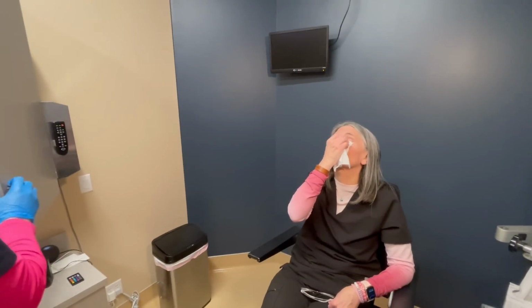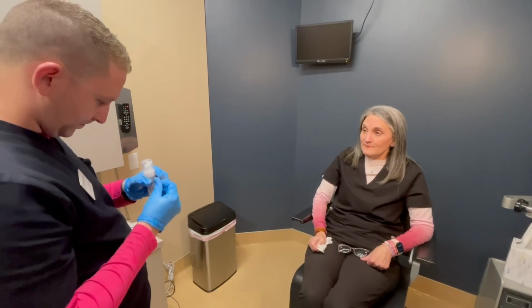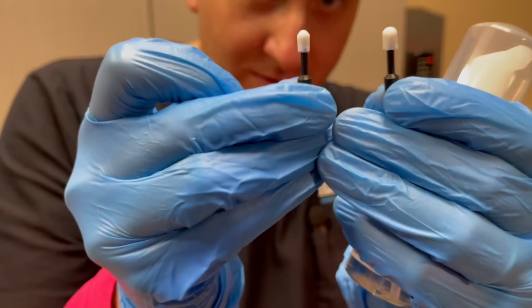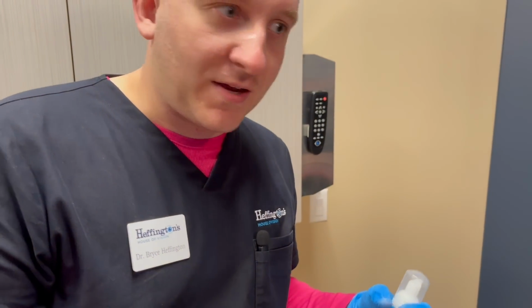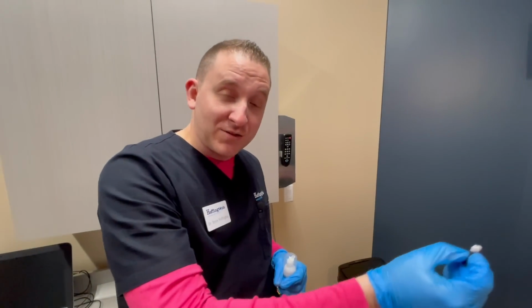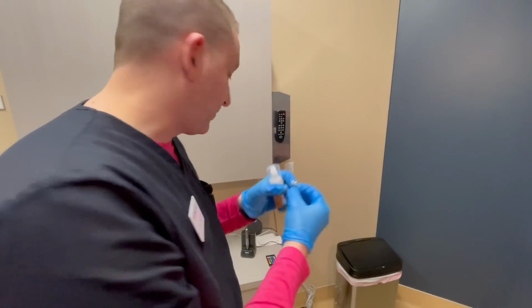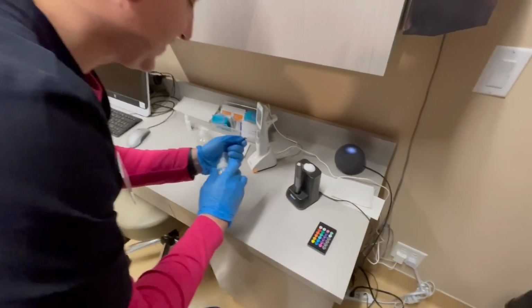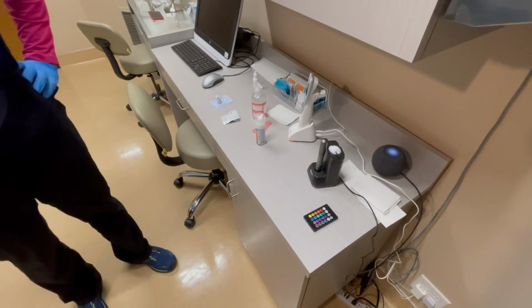While she's doing that, we're going to prepare the BlephEx tips. How we prepare the BlephEx tips is that we get these two little devices out. They kind of look like Q-tips, and we soak them in this little disinfectant foam, or antibiotic foam in this case. And we're just going to scrub the outside of the eyelids, removing the biofilm, as well as removing the hardened oil gland capped over portions of her meibomian glands. Just get a couple little spritzes there, and just let those sit for about 20 or 30 seconds or so.